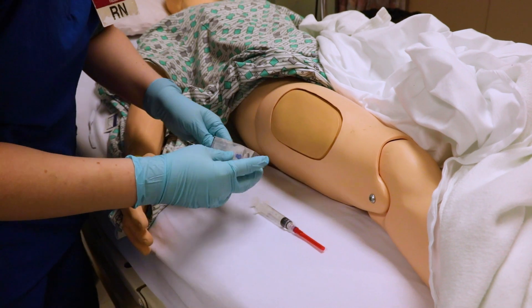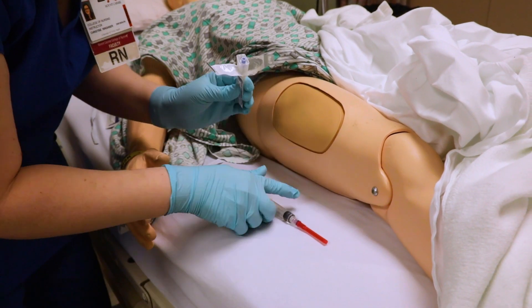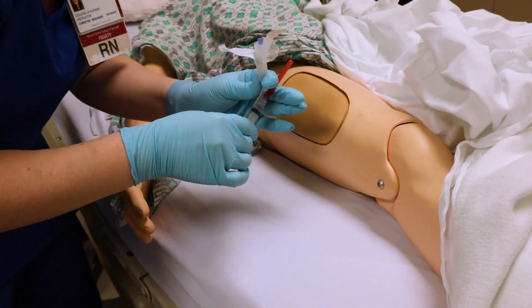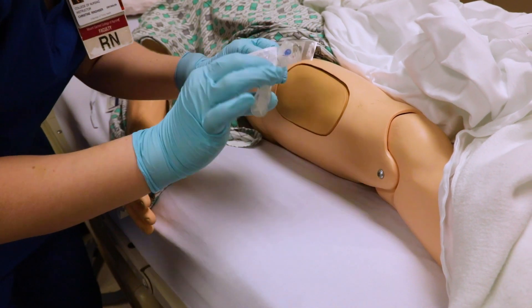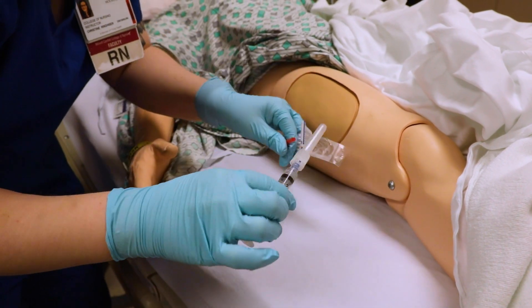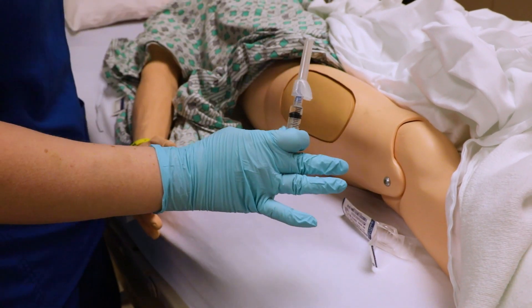I'm going to open up the needle. As you may remember from the previous video, this is a blunt needle — we don't want to use blunt needles on our patients. I'm going to connect these like this, and this blunt needle is going to go in the sharps container.